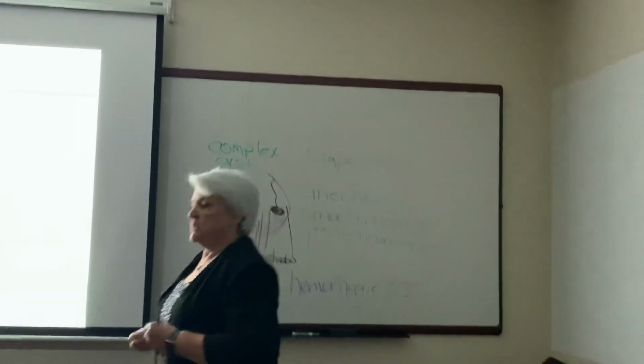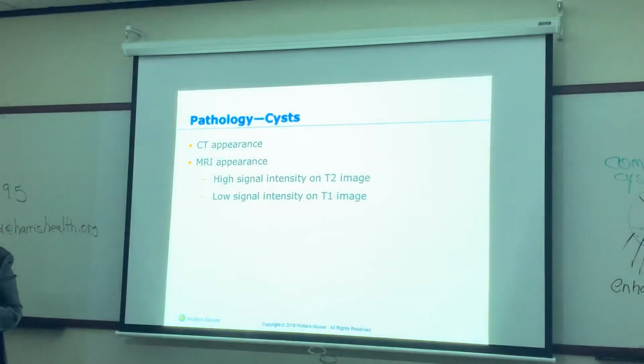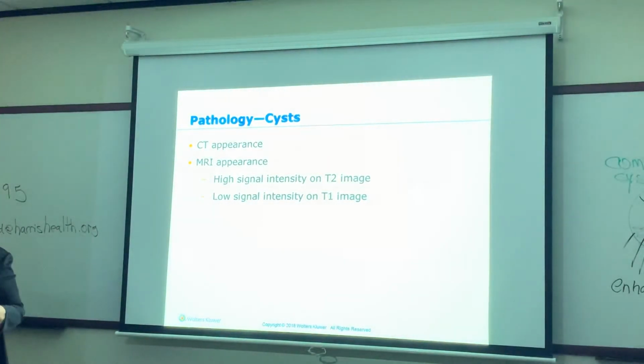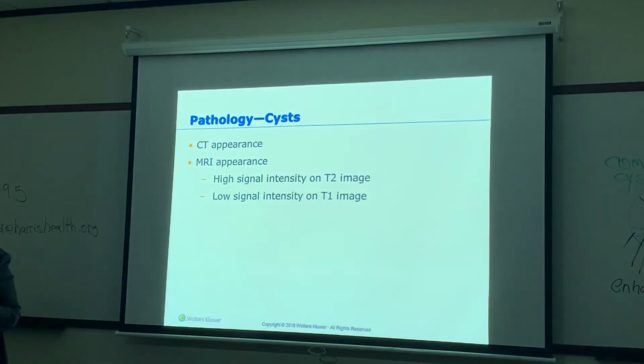Okay, so I send my patient, we find something in ultrasound, because there are some things in ultrasound that we can't see very well, that MRI is better for. Like fibroids. We can count the fibroids, we can tell the doctor where they are, but we can't see them as well as MRI can. So why doesn't the doctor just do an MRI? Number one, cost. Number two, time.